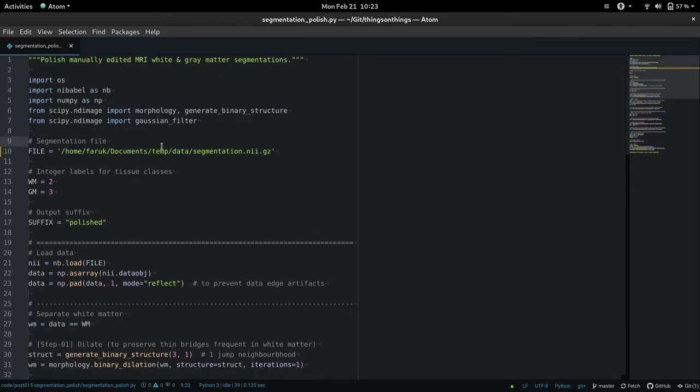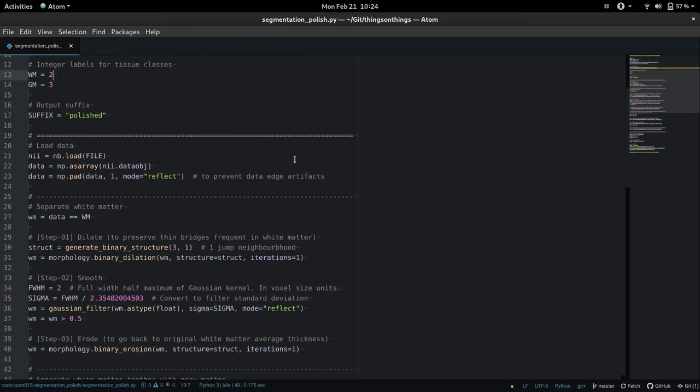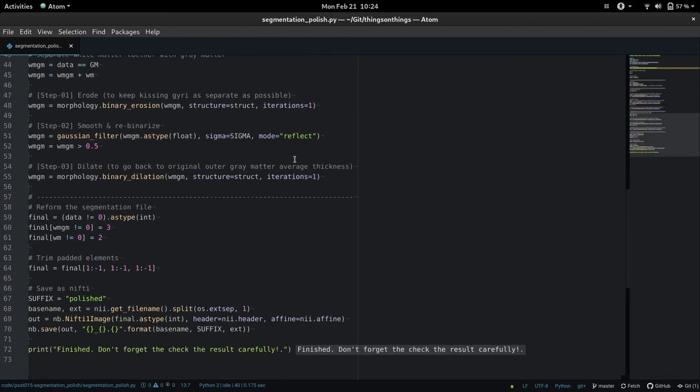I might shoot a longer video later to show the details of the script but basically all you need to do is to enter the file path to your segmentation here and then run this script. So I'm going to quickly run it in Atom.